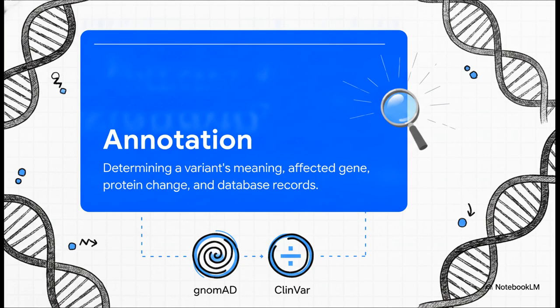We start by decoding the variant through a process called annotation. Annotation software tells us exactly which gene is affected and what happens to the resulting protein. Did the mutation cause a missense change altering an amino acid, or was it a nonsense change, creating a premature stop codon that truncates the protein entirely? We then cross-reference that variant in massive public databases. For example, we check gnomAD. If a variant has a population frequency greater than 5% in healthy individuals, well, it's generally not considered the cause of a rare disease. We also check ClinVar, a global database where labs report whether a variant is actually connected to a specific illness.